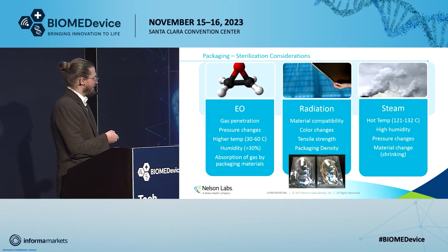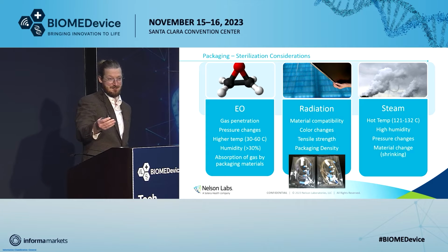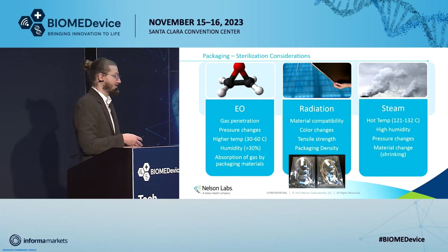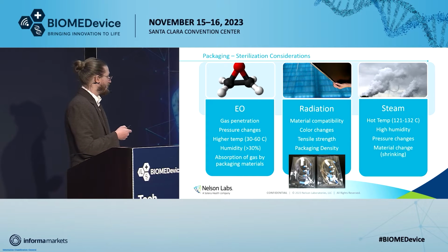We talked about steam a little bit. It takes that temperature and raises it to the extreme, because that's what's actually sterilizing your pouch, right? So if your packaging is made of materials that can't withstand those temperatures and it melts entirely, then it's all ruined. So those are all things that you need to keep in mind as you're developing your packaging, choosing your materials, to make sure that it's compatible with the package system that you're presenting.